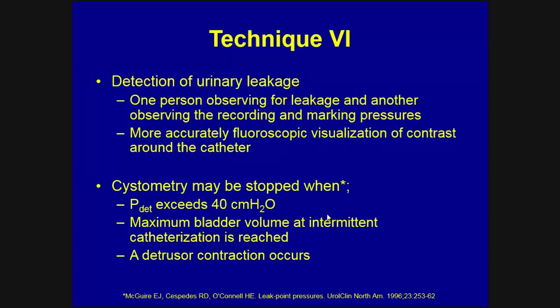Another problem exists about the detection of the urinary leakage. One way of doing that may be one person observing for leakage and another observing the recording and marking pressures. There may be a more accurate fluoroscopic visualization of the contrast around the catheter in video urodynamic studies.